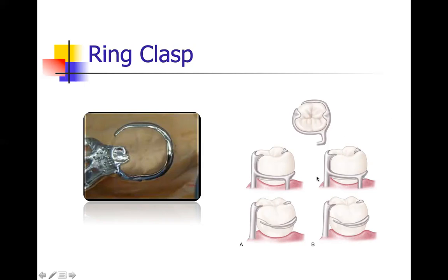These are the supporting struts, on the non-retentive side, with or without an auxiliary occlusal rest on the opposite marginal ridge. The supporting strut should be regarded as a minor connector from which the flexible retentive arm originates.